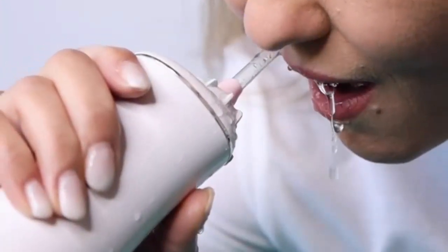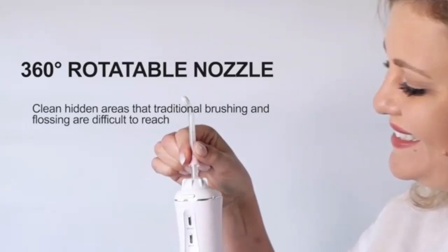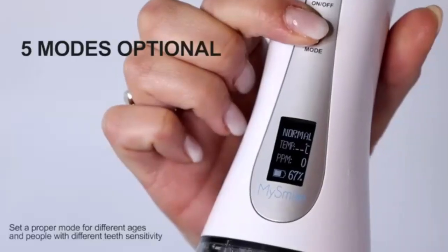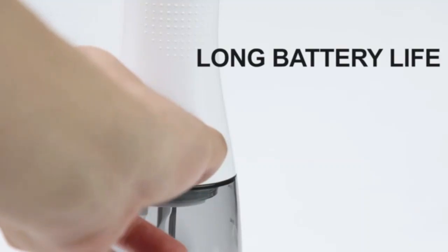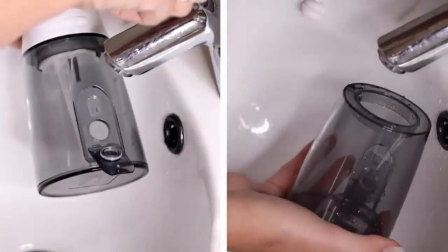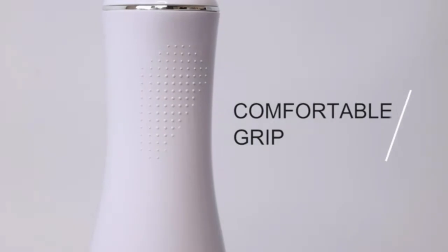Introducing the Beyond MySmile LP221 UVC Sterilizable Cordless Water Flosser — your ultimate solution for a deep, refreshing clean. This cordless water flosser combines the power of UVC sterilization with gentle yet effective water pressure to remove plaque and debris, promoting optimal oral hygiene. Designed with portability in mind, it's perfect for on-the-go use. Pair it with your favorite alcohol-free mouthwash for a truly invigorating, gum-friendly cleaning experience. With its sterilizable design, you can enjoy hygienic flossing every time.